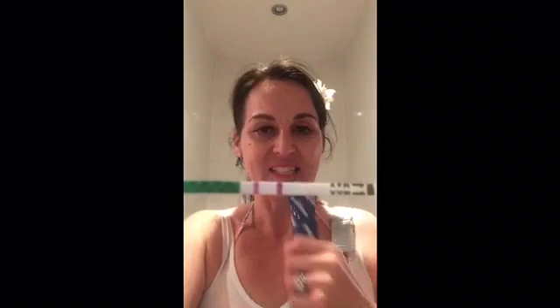But that there, that's the test line, so as you can see it's significantly darker.